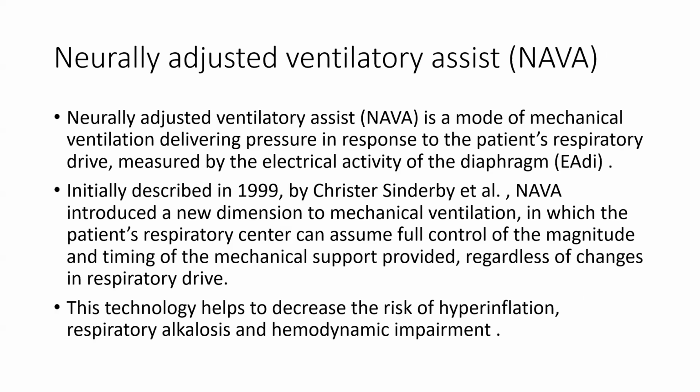Now next is NAVA, neurally adjusted ventilatory assist. It is a mode of mechanical ventilation delivering pressure in response to the patient's respiratory drive, measured by the electrical activity of the diaphragm.